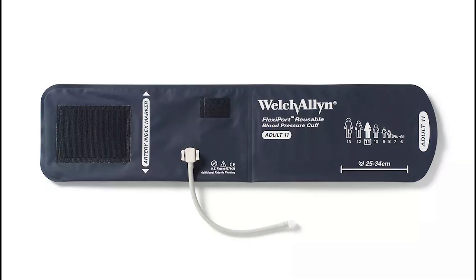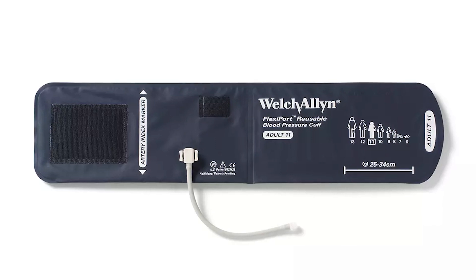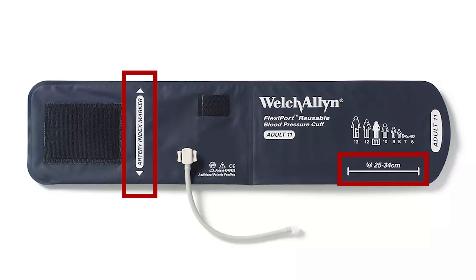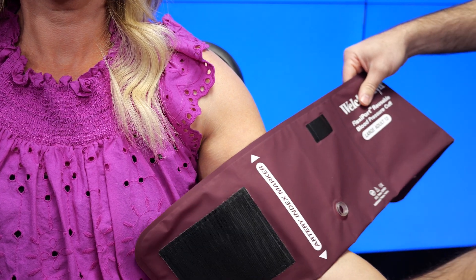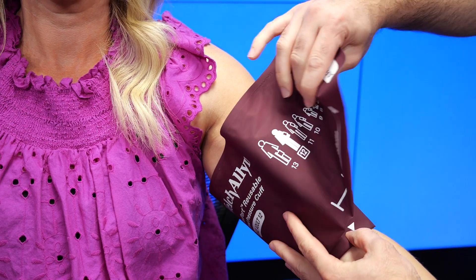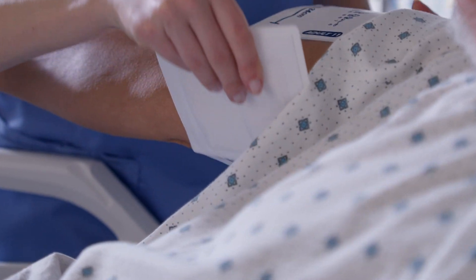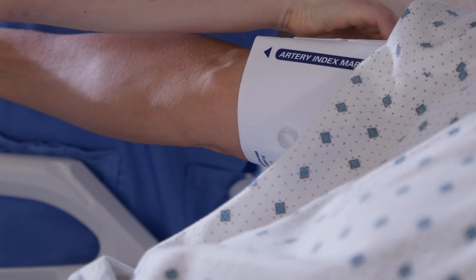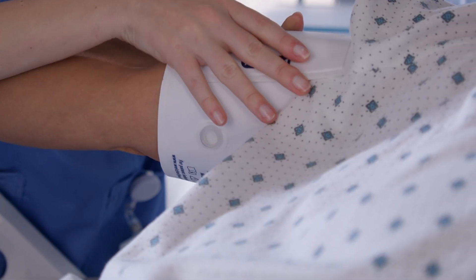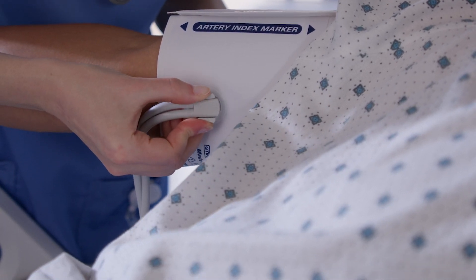Second, check. You want to ensure the correct size cuff is being used on your patient. Check to see if the artery index marker falls within the range markings on the cuff. If your patient's index marker is bordering closely to the left-hand side of the range, your cuff is too large and you should go down to the smaller size. If the index marker is bordering to the right-hand side, the cuff is too small and you should go up to the larger size. If two different cuff sizes could work for your patient, always choose the larger size.